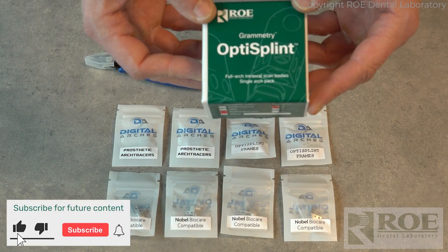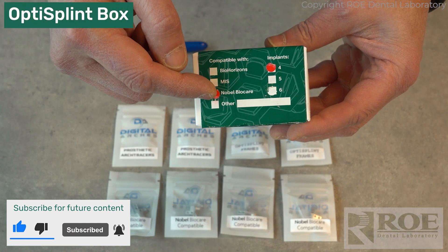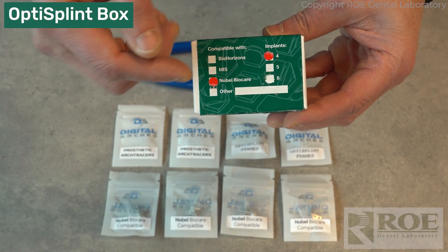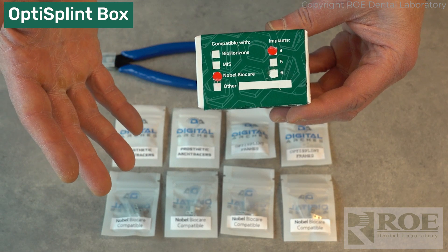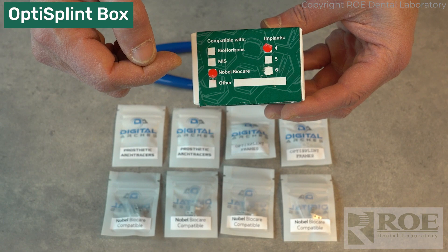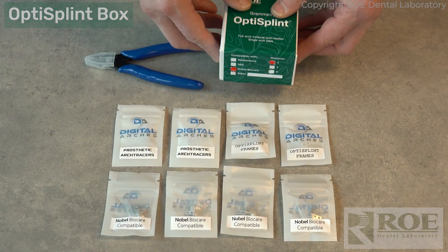What is in a Grammetry OptiSplint kit? This particular case has Nobel for four implants, and what that means is that the OptiSplint, which fits Nobel multi-unit abutments, is set up for a unigrip screw because it's Nobel and it's for four sites. That's how you confirm what's in the box.